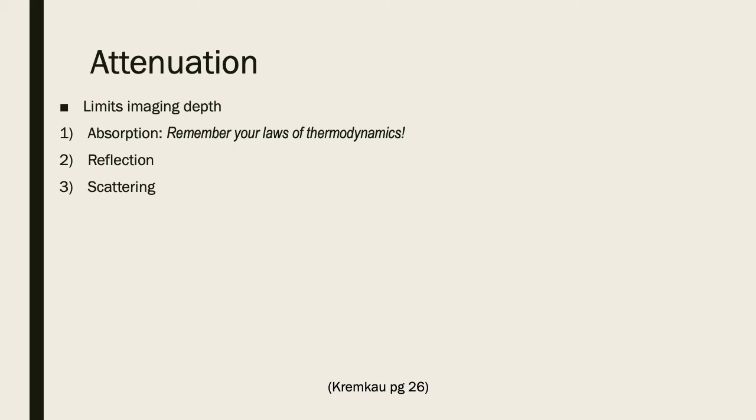The first one is absorption. So remember, when we talk about absorption, we have to go back to very basic physics, which is that energy can never be created or destroyed, but it can be transferred. If we break down what sound energy is, it really is just a mechanical type of energy, and we have particles in our body that are vibrating or resonating at super high frequencies.